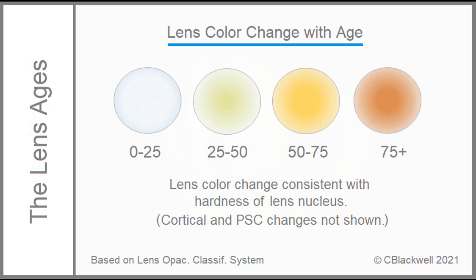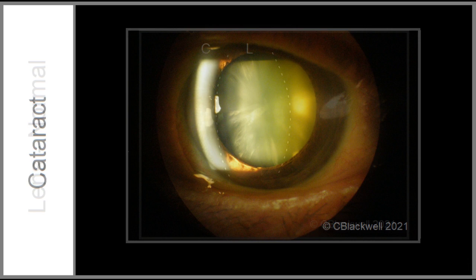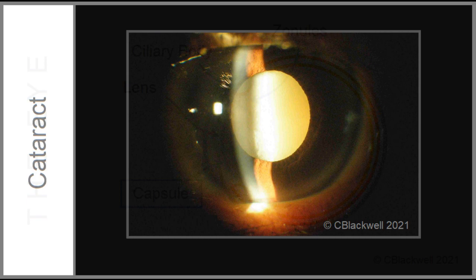This is looking into a normal eye through a dilated pupil using a microscope with a bright slit beam of light coming from the left side. The cornea is the curved vertical bar on the left. On the right is the lens outlined with dashed lines. This is a youngish, relatively clear lens. This is a middle-aged, mild to moderately cloudy and yellowed lens. This is a late-stage, densely cloudy lens.